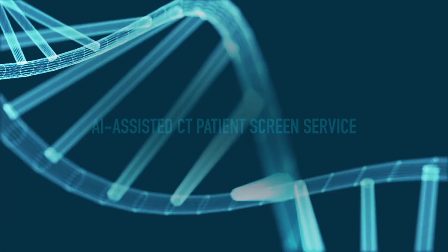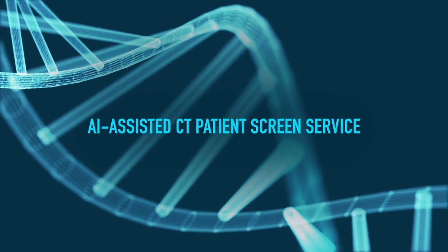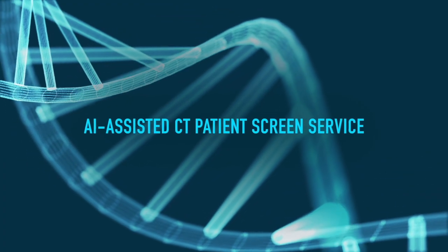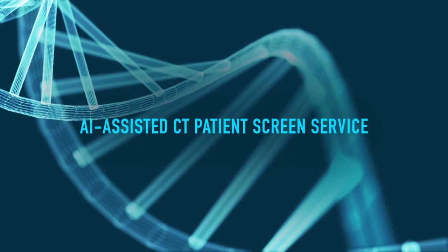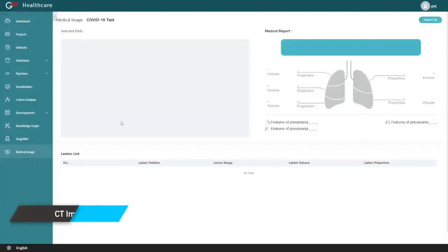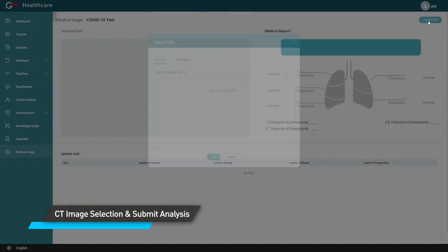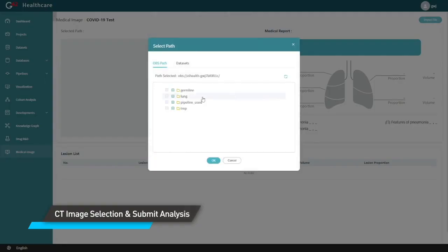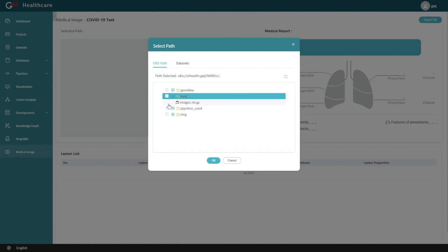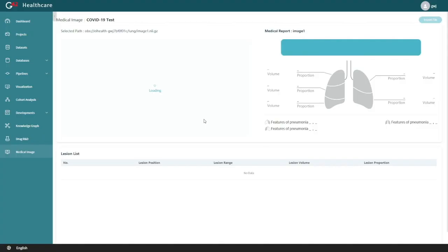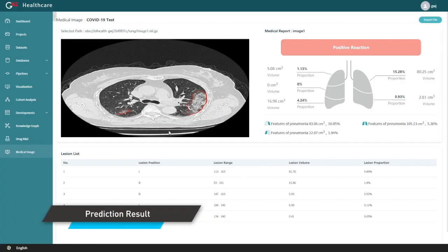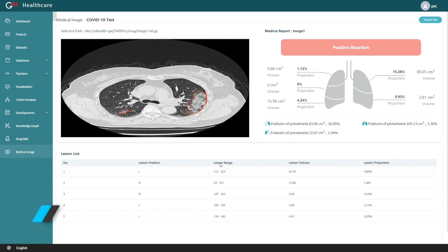The AI-assisted CT Scan Evaluation Service supports and accelerates a radiologist's review by providing quantitative measures for single or longitudinal evaluations. The platform uses deep neural networks to segment the abnormalities observed in the CT scan, such as ground-glass opacities and consolidations, to enable rapid quantification of their extent on patient's CT scan.